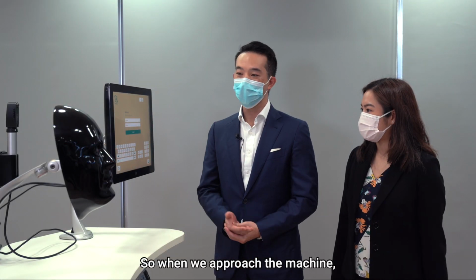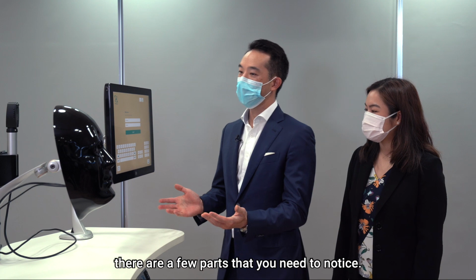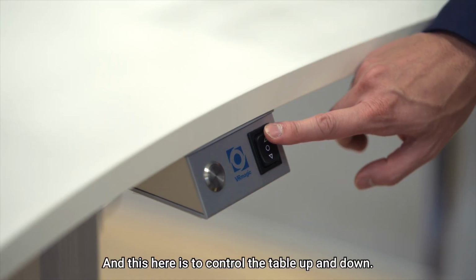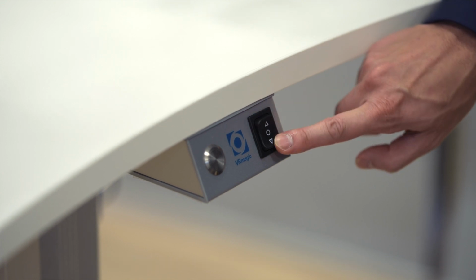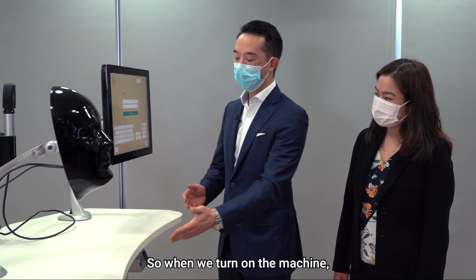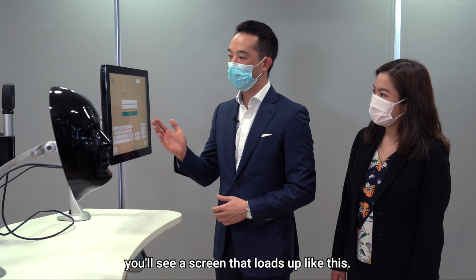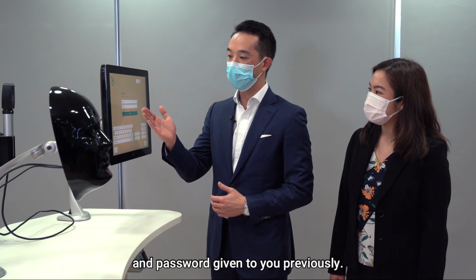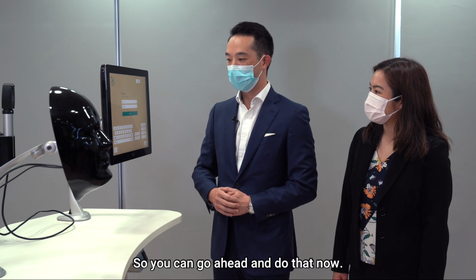So when we approach the machine, there are a few parts that you need to notice. One is the power up button here, and this here is to control the table up and down. So when we turn on the machine, you'll see a screen that loads up like this. And this is where you enter your username and password given to you previously. So you can go ahead and do that now.